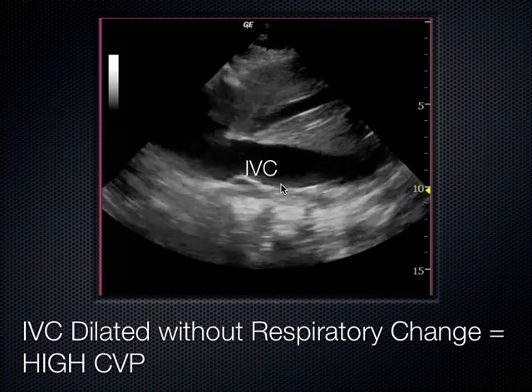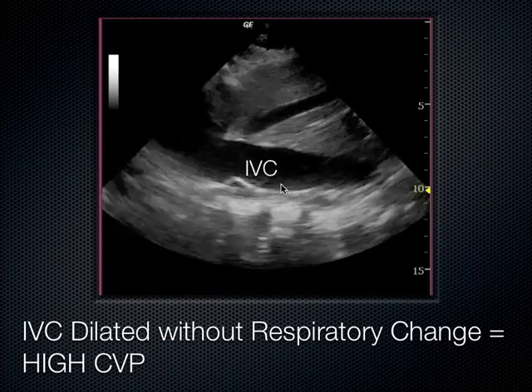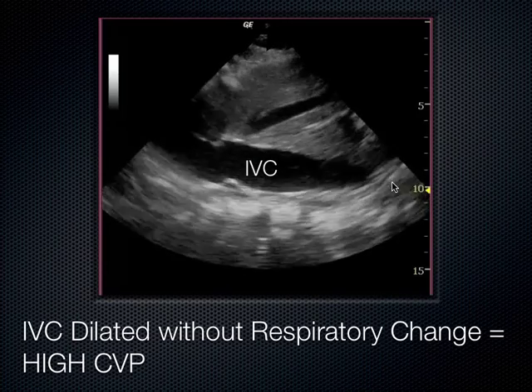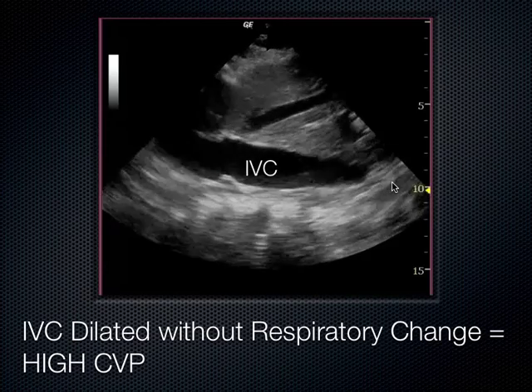Any questions about the IVC, CVP stuff? Yes? So when you float a filter, where is it going to land? The filter lands much more distal to this, usually down lower, distally, not underneath the liver, typically.